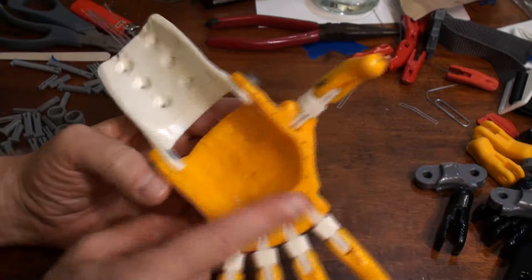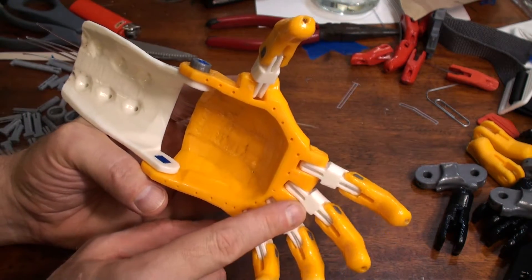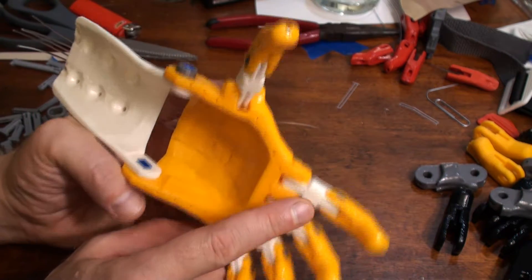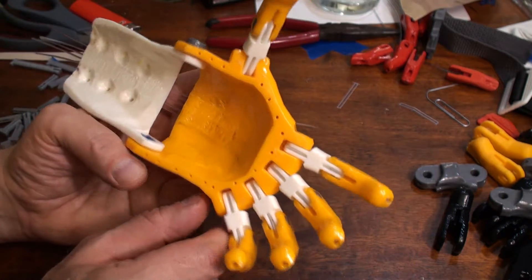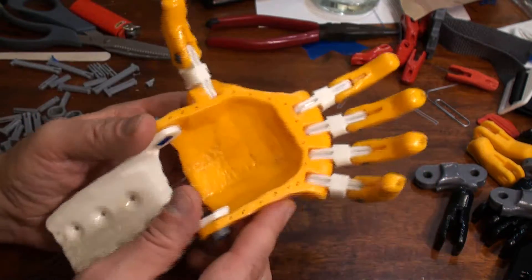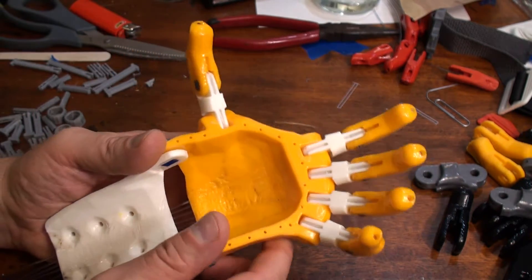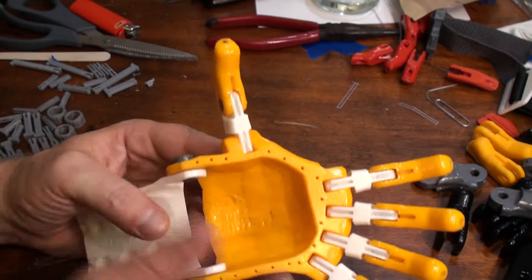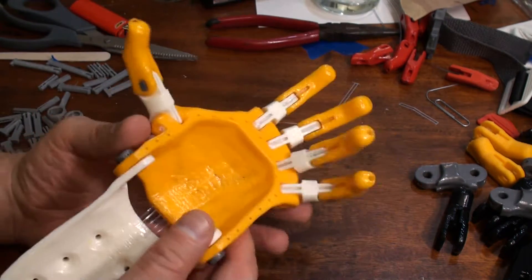I'm also going to try reducing the angle here. There's actually 15 degrees between each of the fingers — 15 degrees here, 15 degrees here, 15 degrees here — for a total index-to-pinky angle of 45 degrees. I also turned the thumb a little bit, which is actually already turned in the Osprey.